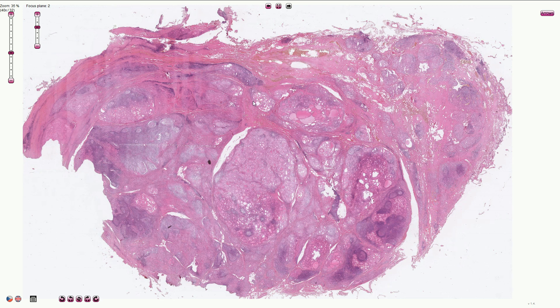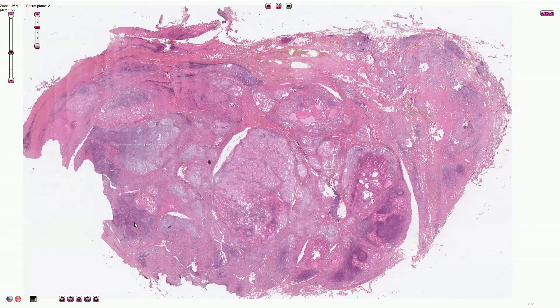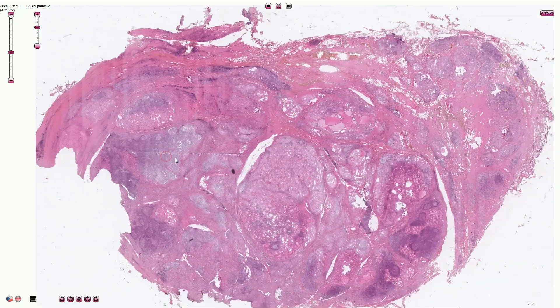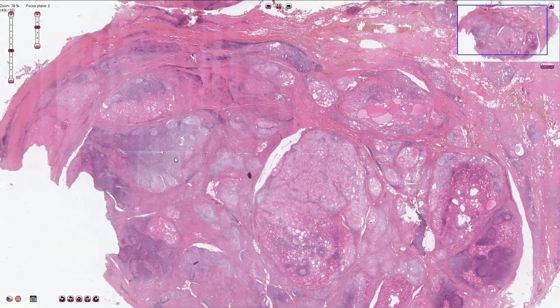Hashimoto thyroiditis, as already mentioned, is an autoimmune disease mediated by lymphocytes, and that's why we typically see lymphocytic infiltration in the thyroid gland. All of these darker areas represent lymphocytic infiltration, and here and there we can even see something that looks like a lymph node inside of the thyroid gland.